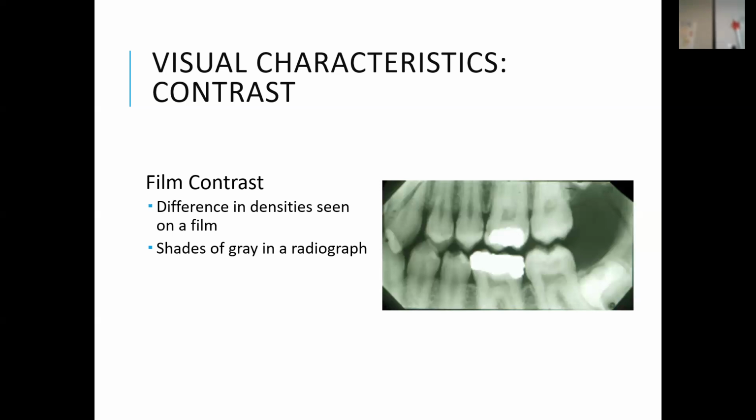So I think what changes is that chemical skin. You can scratch the emulsion off before you take the x-ray, and then you damage the end result picture. That emulsion is necessary to make the picture. So I think they just have different chemical makeups of it. The older ones maybe needed more radiation, or might have been sensitive to light differently. The older ones just weren't as sensitive, and the newer, faster ones are more radiosensitive, so it takes less radiation to get a picture on the film.